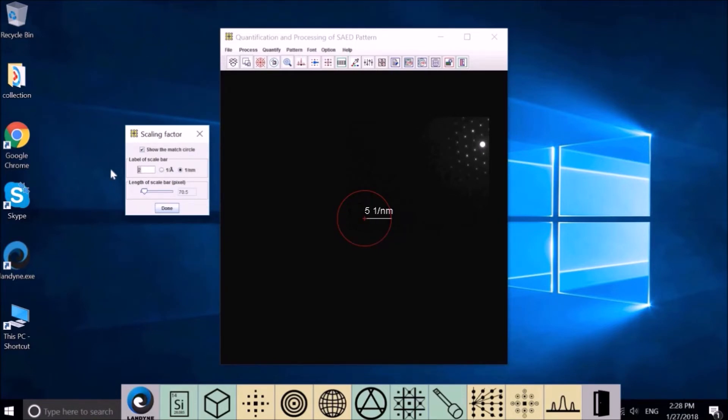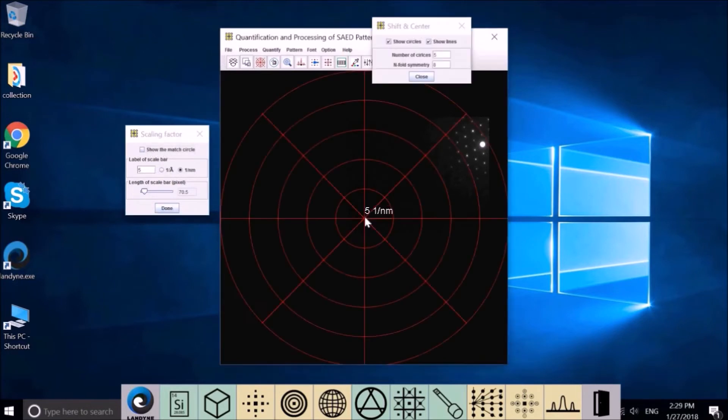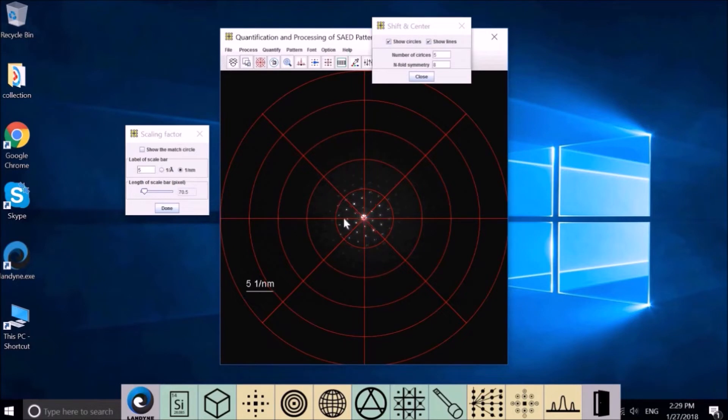Then we can adjust the other end to measure the radius. Then we just fill this number. Here is 5, 1 over nanometer. Select this to 1 over nanometer, put it here to 5. After this, we can bring the diffraction pattern back.